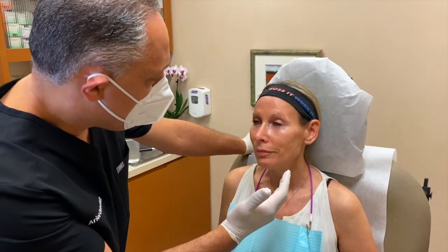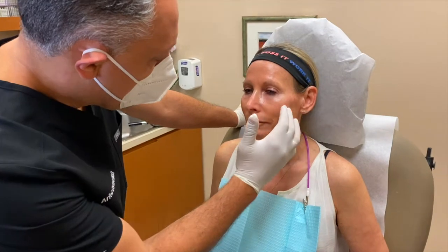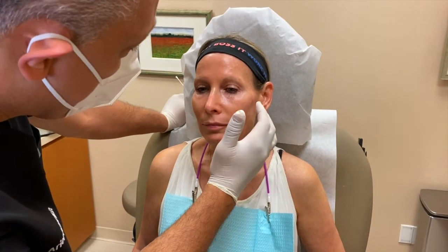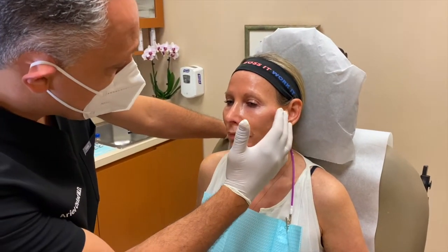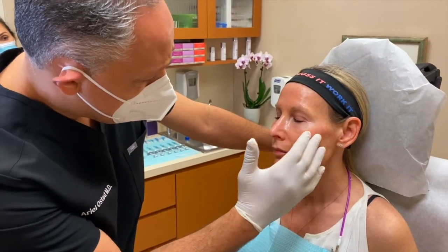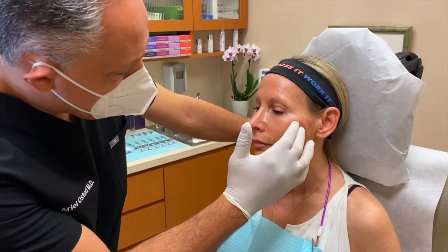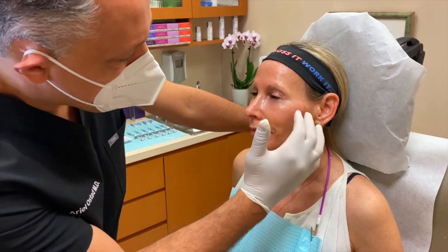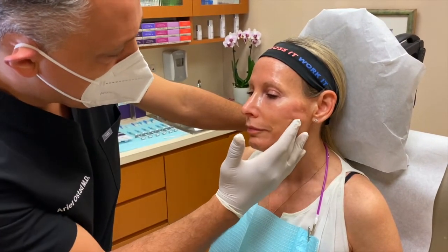What I was trying to explain to you, Adrienne, is that our cheekbones act as support. When we lose fatty tissue over time, the skin sags and pulls down. So the underlying cause of these laugh lines is loss of fatty tissue and support. Our bone resorbs, the fatty tissue is lost and moves down and sits here, and we lose collagen. By injecting some fillers here, you will see how your cheek will lift up and your laugh line improves. You will also see how we can elevate the jawline, and your jawline will actually lift up.